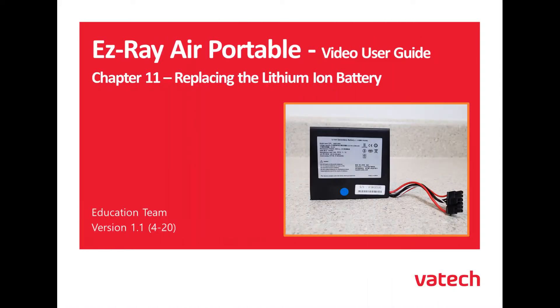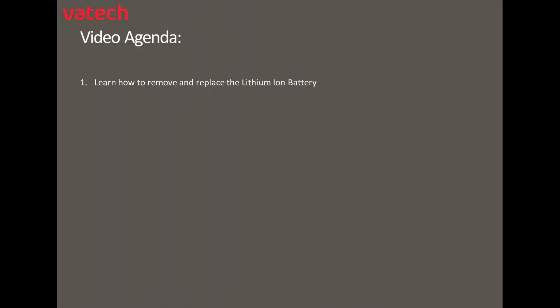The Ez-Ray Air Portable Video User Guide, Chapter 11: Replacing the Lithium-Ion Battery. In this video today we'll learn how to remove and replace the lithium-ion battery.